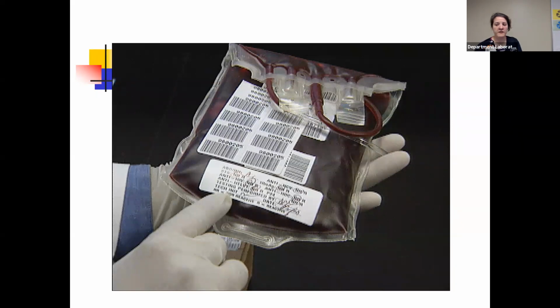I mean, we've talked about this before, but this is actually the back side of your unit. So if you guys remember the front side of the unit, it has your unit number embedded in this barcode. And so on the back of the unit, you have all of these stickers. And so these can peel off. So if you are cross-matching the unit or you're confirming your ABO RH upon receipt, you can peel these stickers off and put it on your tube. It reduces the amount of labeling you're doing by hand. Right, so you can do that.